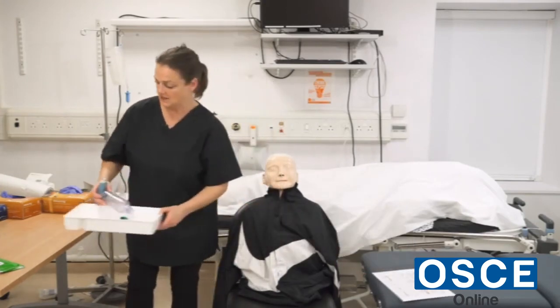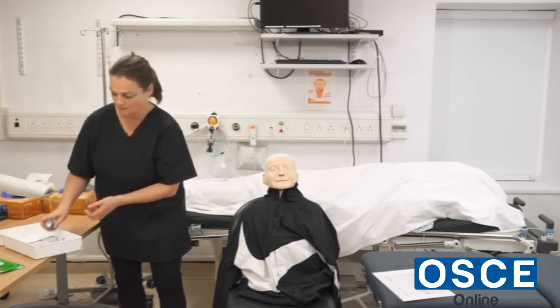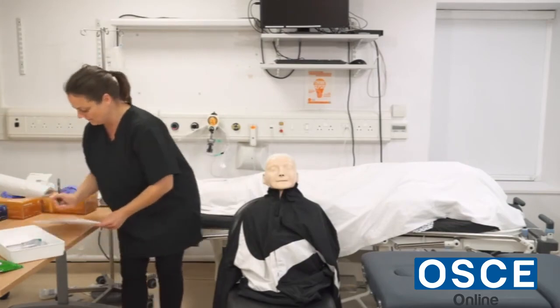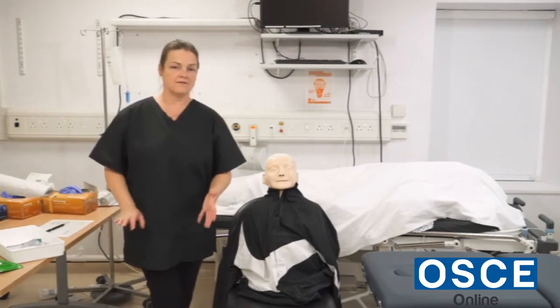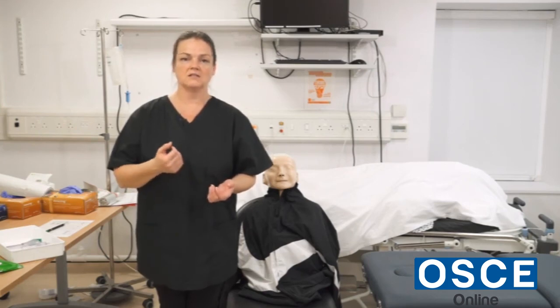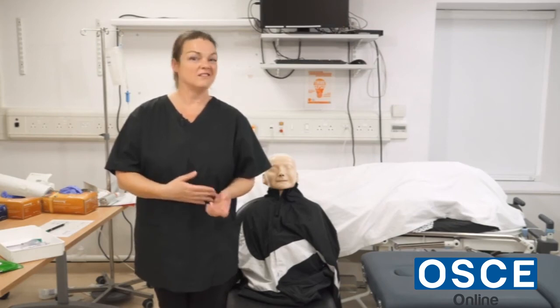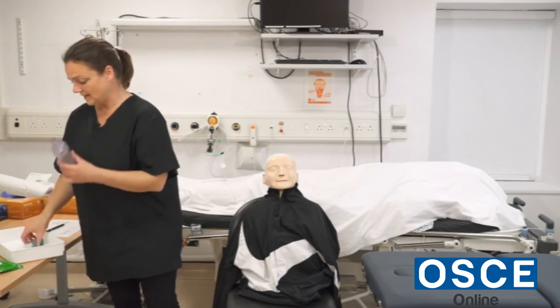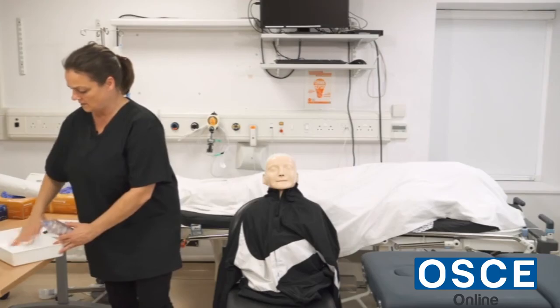I would take these pieces away and clean the spacer device and the tray. Make sure I sign for the medication straight away. And I would document in the notes that I have given Peter the 2 measured doses. He used the correct technique, and he's looking well at the moment. Advice given, and then I would put this stuff back where I found it, cleaning this spacer device after use and the tray.